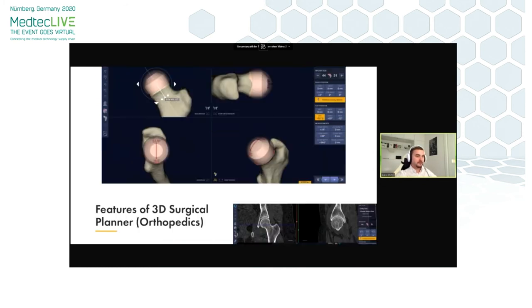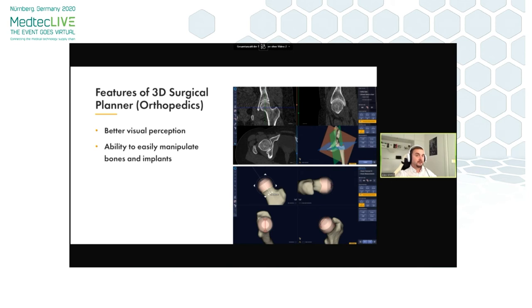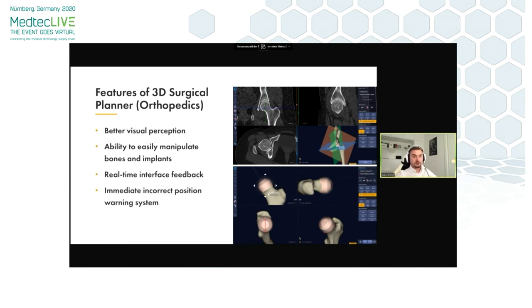To sum up, the visual perception here is vast and allows us to see all the important details. The next big thing is the ability to easily manipulate bones and implants — the software is highly responsive so any interaction works in real time. In addition, there is an immediate incorrect-position warning system that notifies the user right away. Last but not least, the software automatically generates a PDF surgery plan that you can easily print and take with you to the theater.